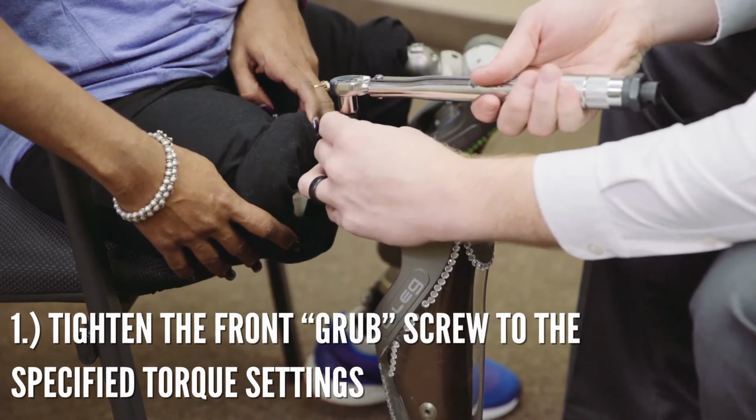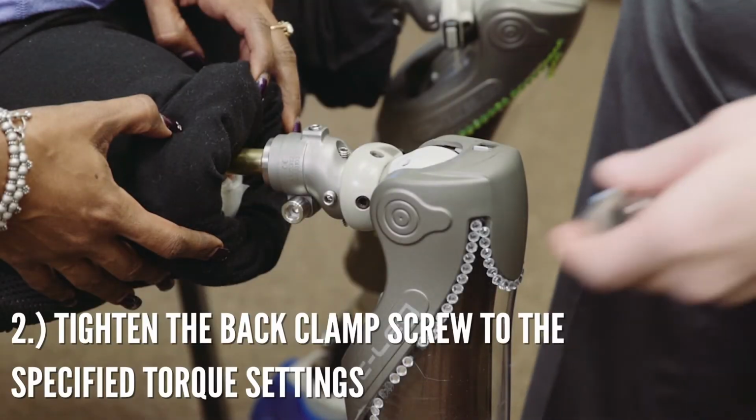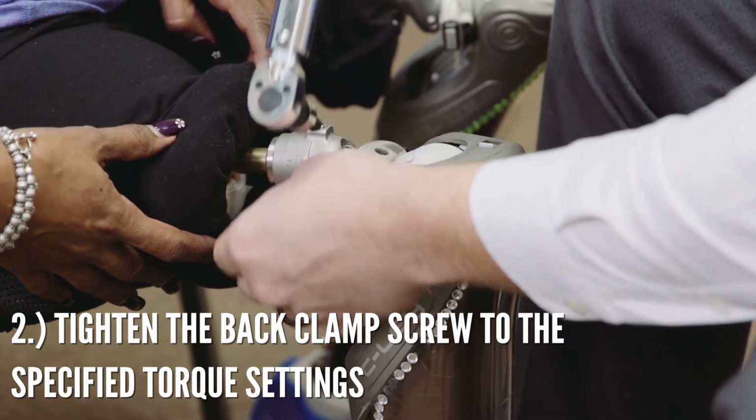While it is not realistic for each patient to have a torque wrench available every time they put their prosthesis on, it would be helpful for a prosthetist to show the patient about how tight 5 Nm is for their reference.